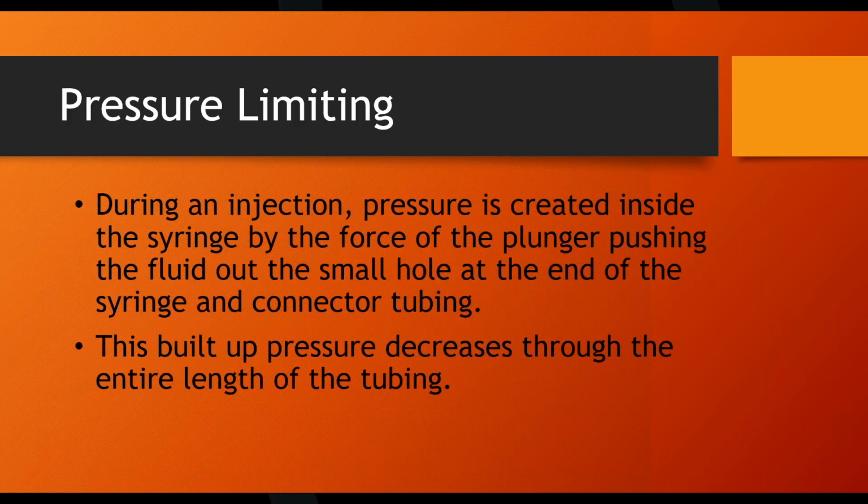5 psi, 10 psi, that's fine. We don't care about that. That's not the goal. We're just saying don't go higher than that. Anything below that, and we're good. So keep that in mind.